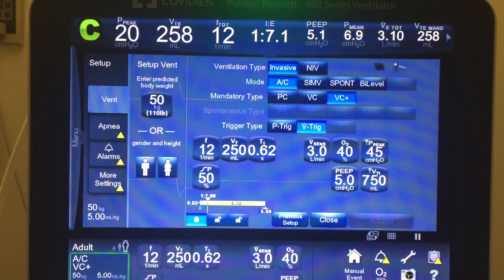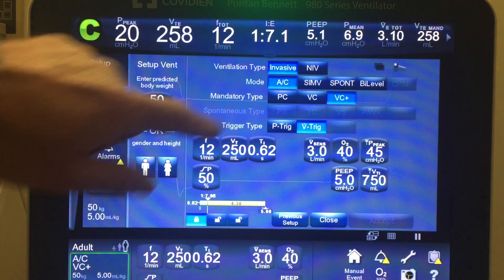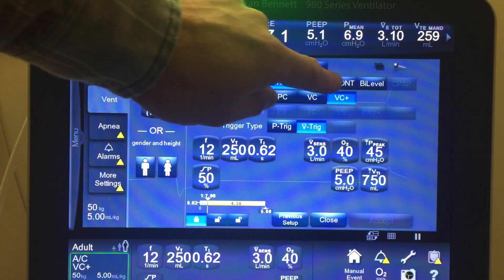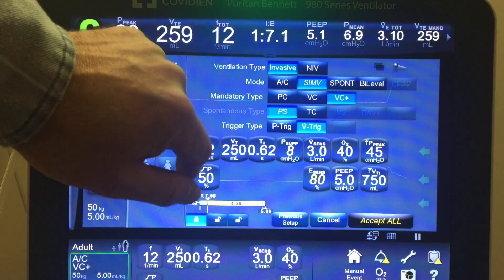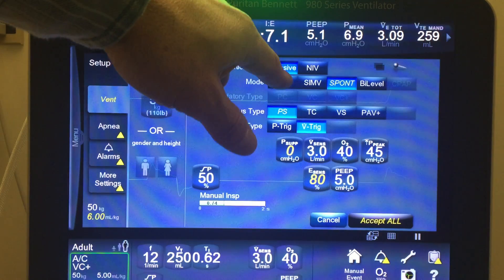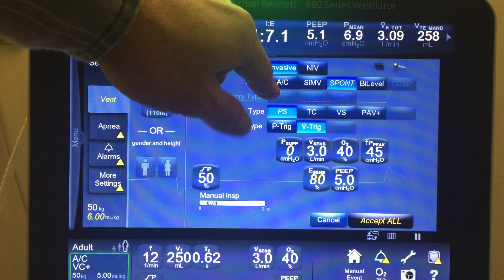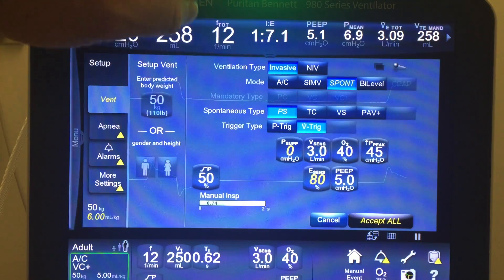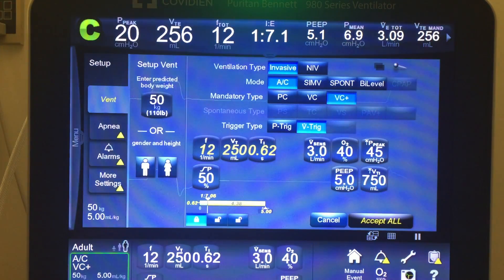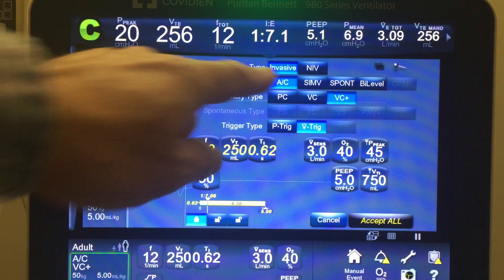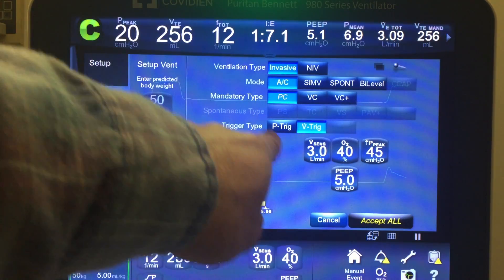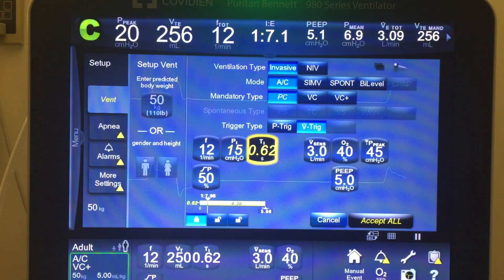I'm going to talk about pressure control now. Opening the menu on the 980, I can do pressure control in assist control or SIMV, either one. Notice if I try spontaneous it goes away, because pressure control is for mandatory breaths — all the breaths in assist control and the mandatory breaths in SIMV. So we're going to go ahead and hit that, and you notice our menu options change for what we can set.